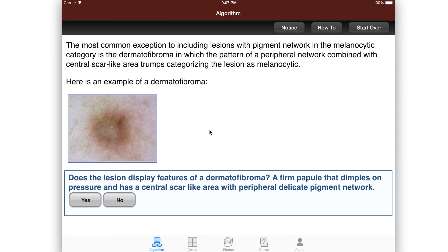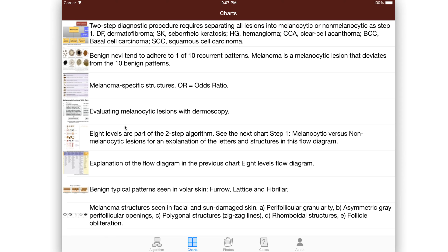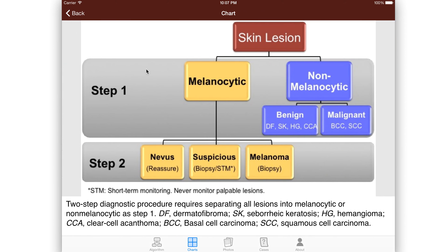The other thing you can do, besides following the algorithm, is that you can go to the charts. The chart actually explains the algorithm — what we mean by step one: is it melanocytic or non-melanocytic? And then step two, if it turns out to be melanocytic, is it a nevus? Is it melanoma? Or is it suspicious, something in between?